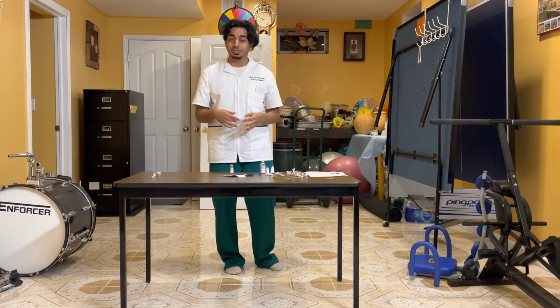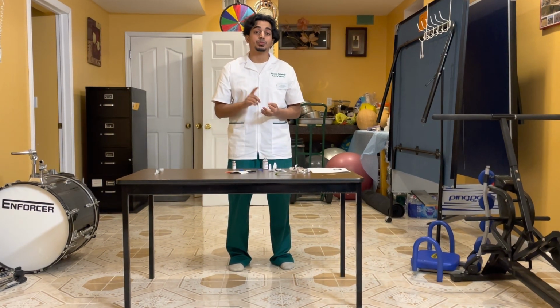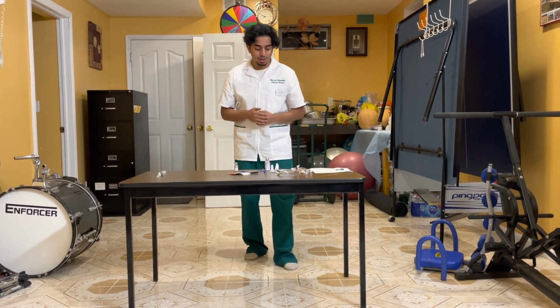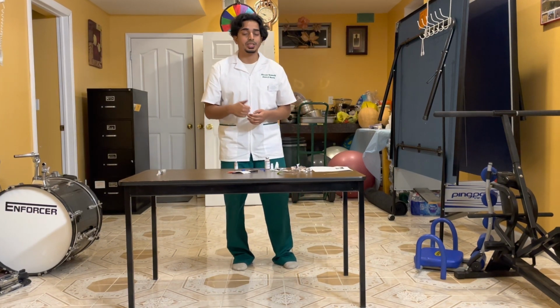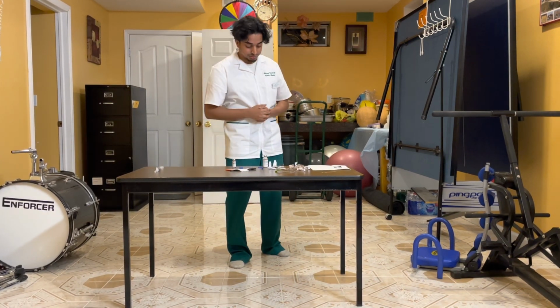Before we go to the room, I just want to say as well the 10 patient rights, which are right patient, right medication, right dose, right time, as well as the right route. Okay. In addition to that, the patient has the right to education, assessment, documentation, evaluation, and the right to refuse.